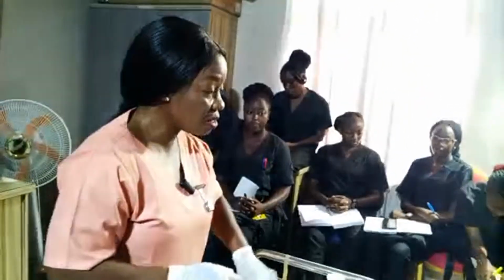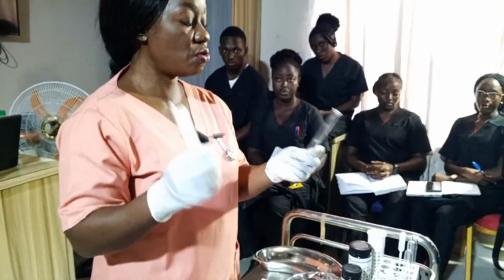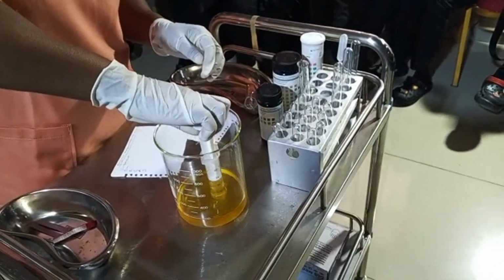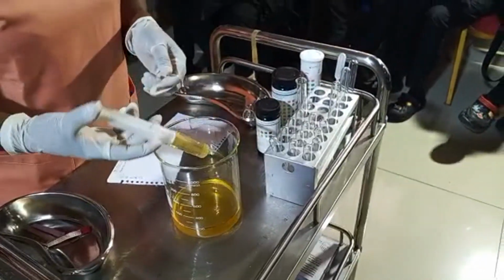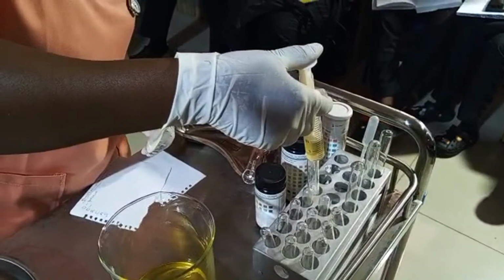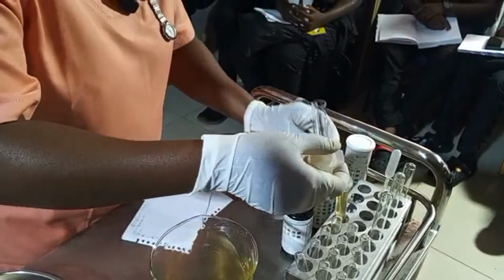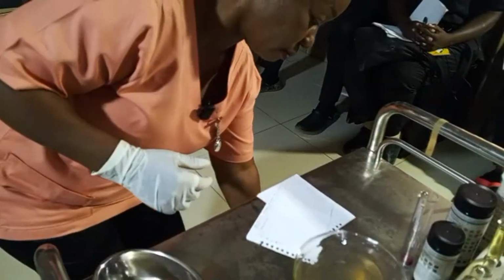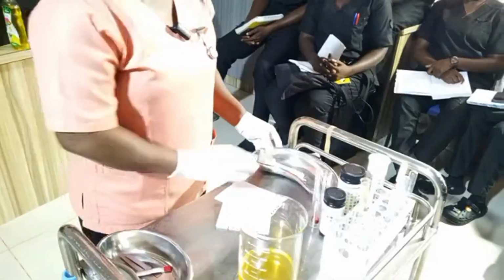Now I will use this syringe to fetch a little amount of urine and I'll put it inside so that I will not contaminate my hand, and I will just pour it directly. Up until now, I don't have any direct contact with this urine, right? Then I will just discard it. I will just discard this in a receiver for used instruments. And I can also leave it here if I want because I may be using it.